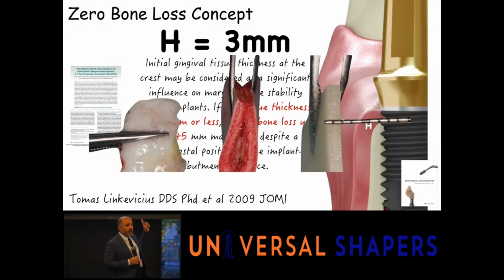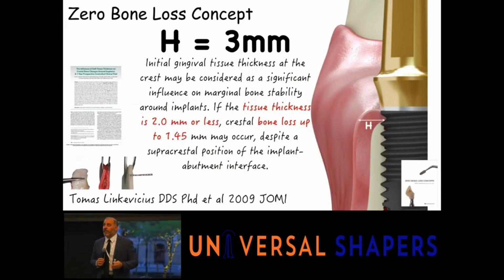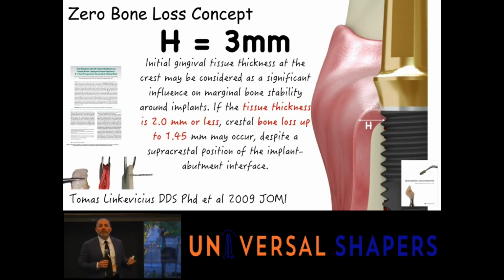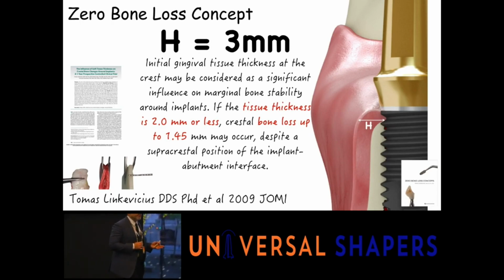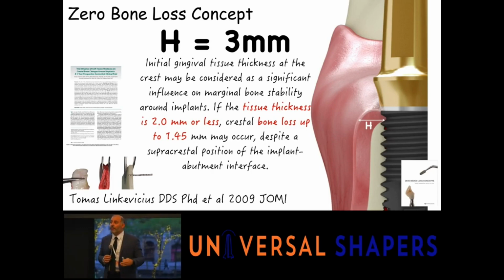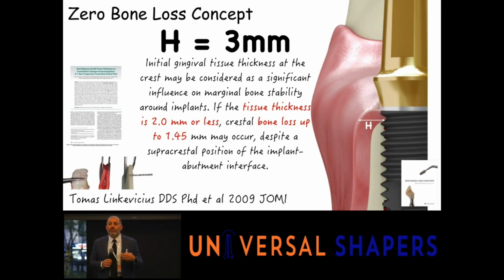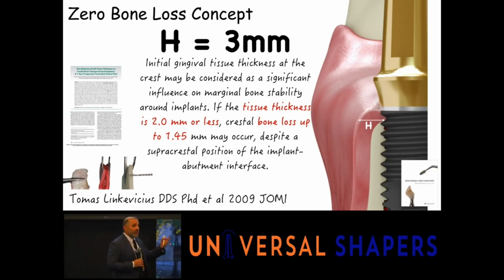Is it because he's doing soft tissue grafting on every case? Is it because he's putting bone in every case? Or is he respecting some of the rules of biology? That if the tissue thickness is 2 millimeters or less, we're going to have bone loss up to 1.4, 1.5 millimeters. That's a significant amount of bone loss, especially if you didn't place your implant deep enough. So despite whether or not you place the implant supracrestal or subcrestal, we still may get this response because of lack of soft tissue. So the tissue is the issue.